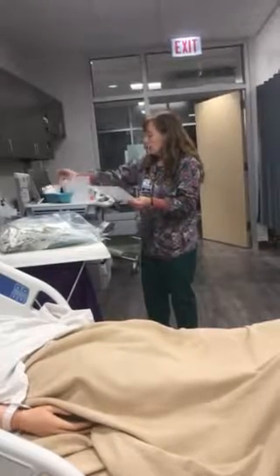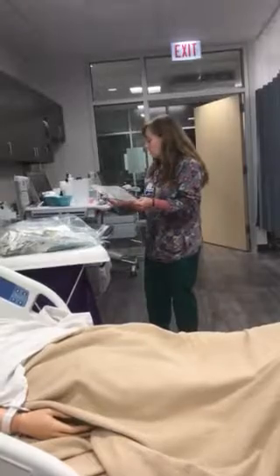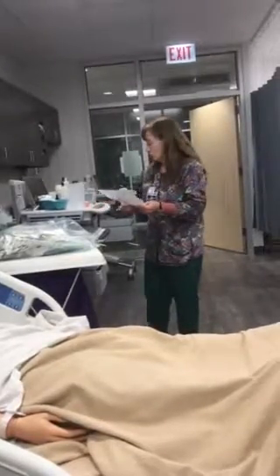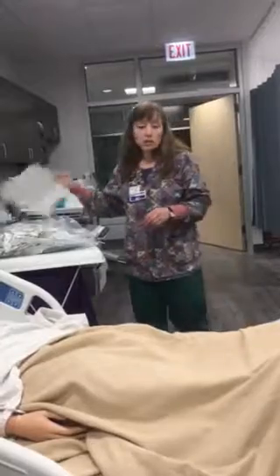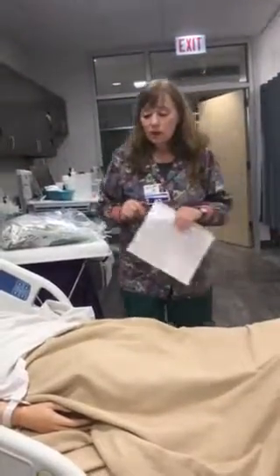This would all get put away in your patient's drawer, and then you're going to be taking your free water in, your digoxin in, your erythromycin, and your Jevity into your patient's room. So as we walk into the patient's room, I'm just going to leave it there. We're going to pretend like we brought it in. First thing you need to do is what? You guys should be used to this. Hand hygiene.